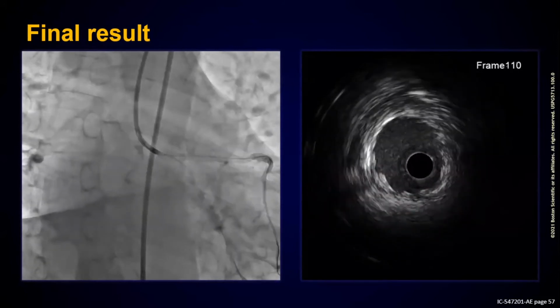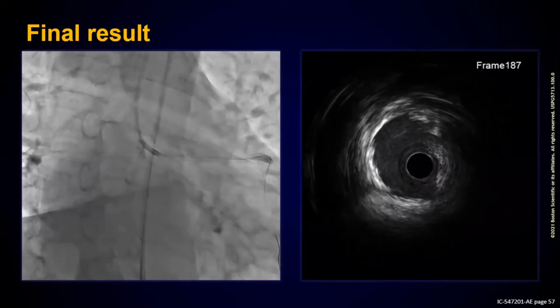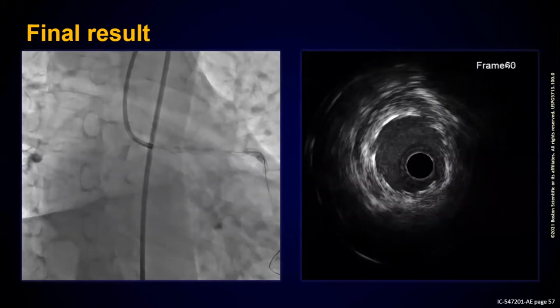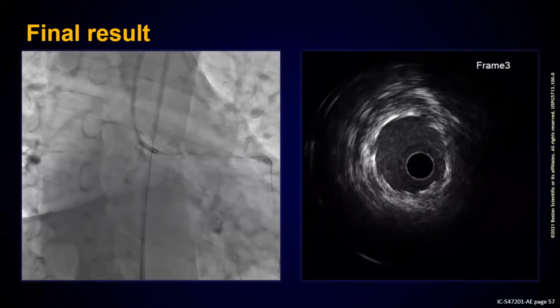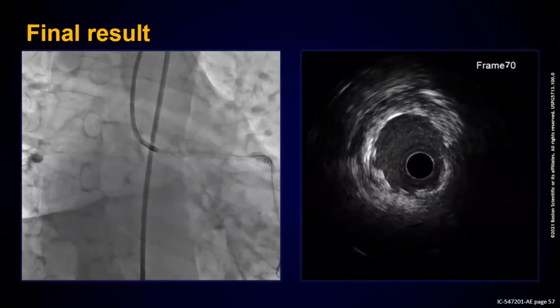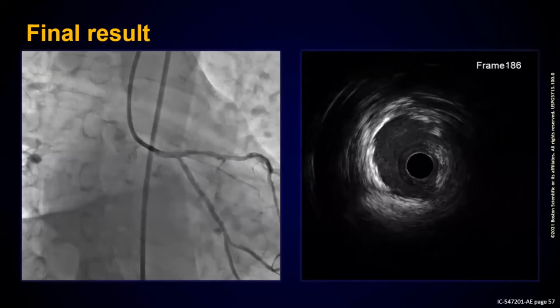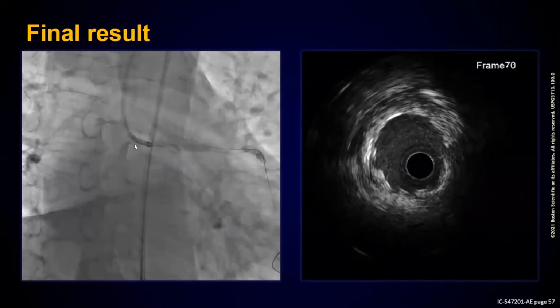in whatever way you want, but as long as the two main important things I always stress on in left main stem are that KBI inflation at the end is the single most important, and getting an optimal MSA in the left main stem, in the distal left main stem and the body, is very, very important. So I will go to the next case.